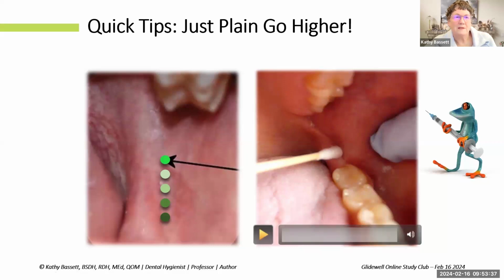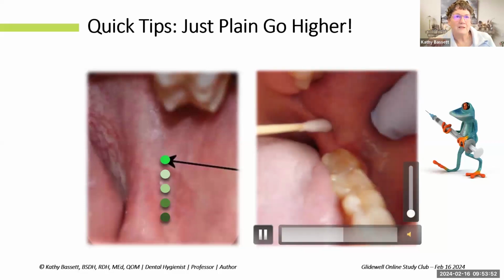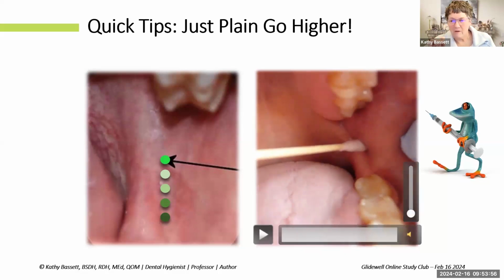just watch. I'm going to start with that cotton swab, literally tapping on the retromolar triangle. Because remember, I showed you the bone in the beginning. So I start tapping on that bone, and then I just walk back until I literally fall off past the internal oblique ridge. And it just puts me in this deep, squishy area. And see how much higher I moved? And it's very, very soft right there.